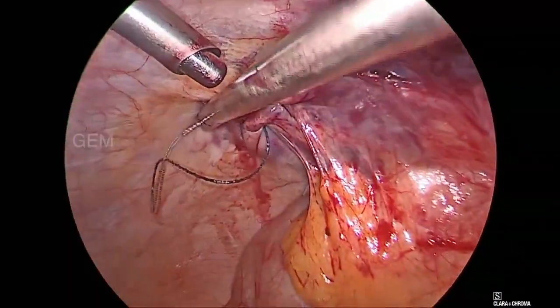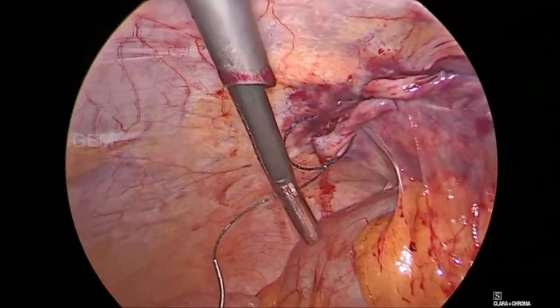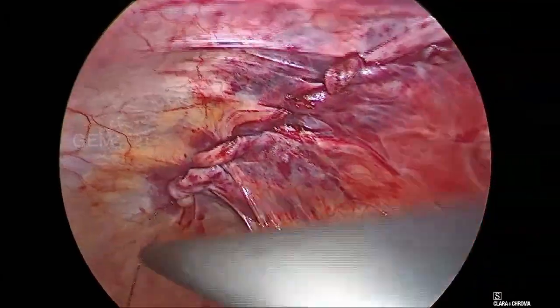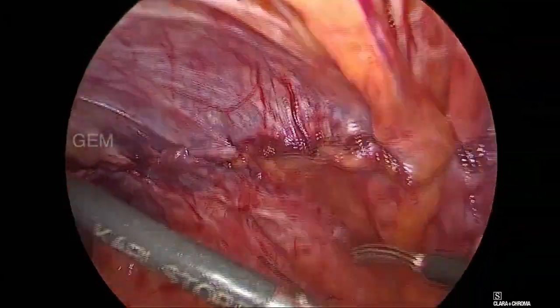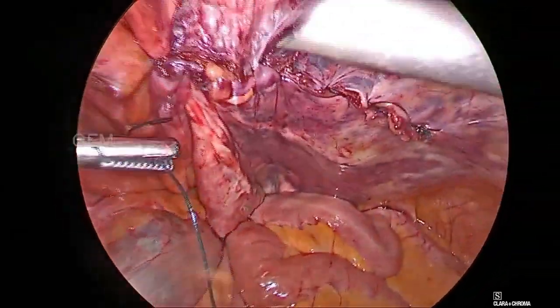The left-sided flap is also completely closed. You should be careful while closing the left side because the sigmoid colon is adherent. The procedure is now completed and the pneumoperitoneum is deflated.